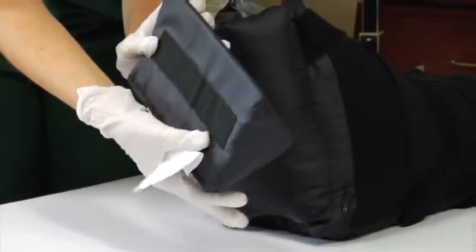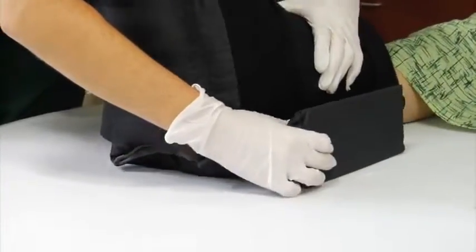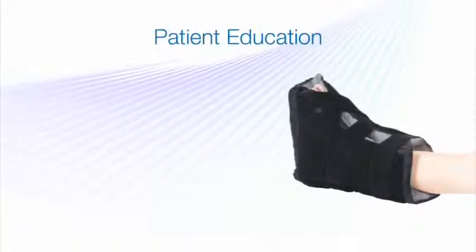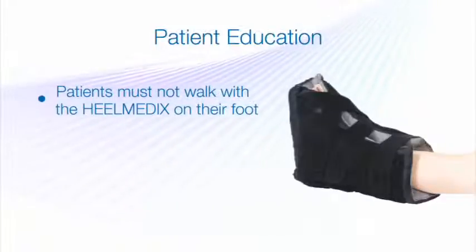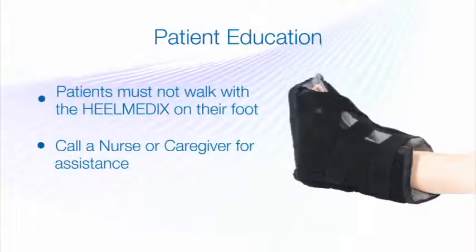The stabilizer wedges are not machine washable. Wipe them clean with a cloth or disposable wipe. They are treated with an antifungal product and are bacteria resistant. Finally, it is especially important to explain to the patient that he or she must not walk with the heelmedix on. If a patient needs to get out of bed while wearing a heelmedix, explain that the nurse or caregiver should be called.